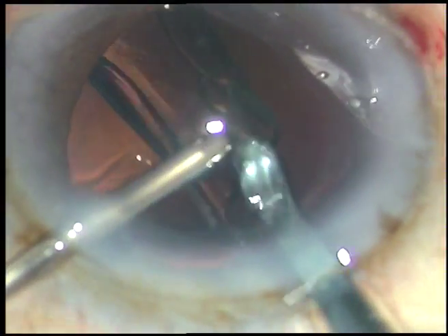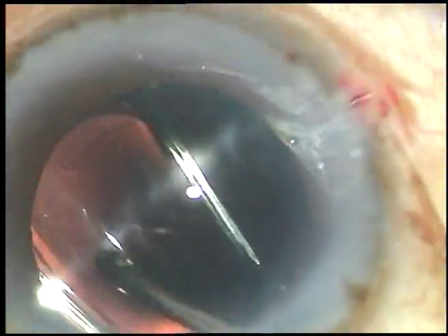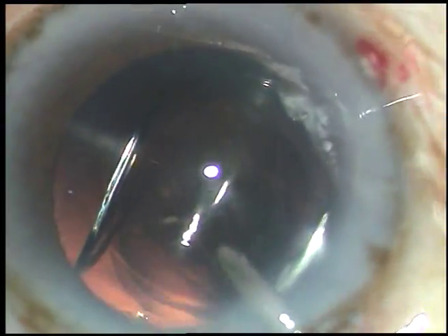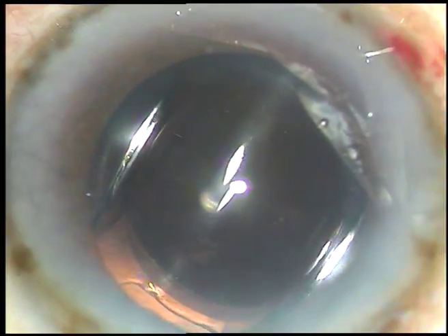This is a beautiful lens from Appasamy Associates — Superfob. It is a thin lens that unfolds very easily but not very fast — ideal unfolding, which is what we surgeons want.